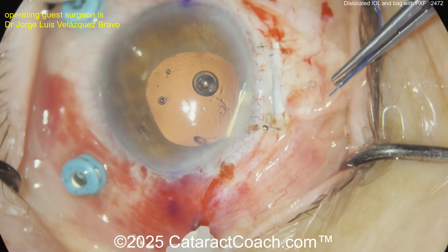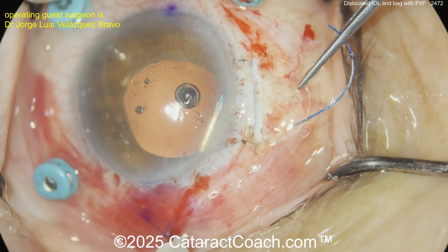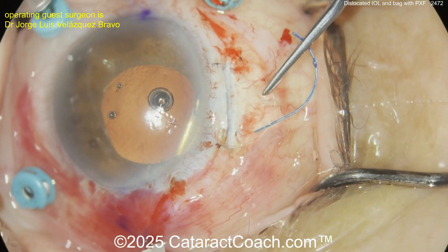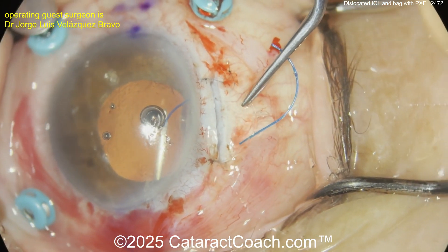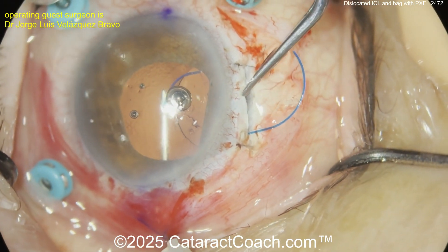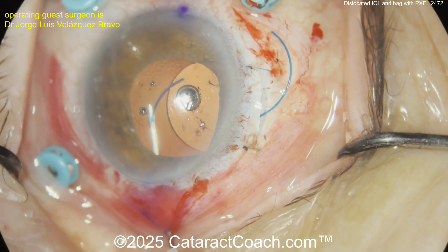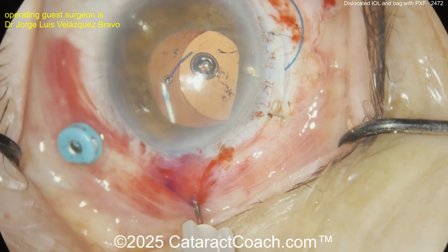Maybe take out one more of those sutures, or maybe it'll fit — will it go? It does go. Very nice. Now you can probably do the same technique for the other haptic. Get that optic in there. This is a vitreoretinal surgeon doing a complete pars plana vitrectomy, certainly cleaning up the anterior vitreous very nicely.